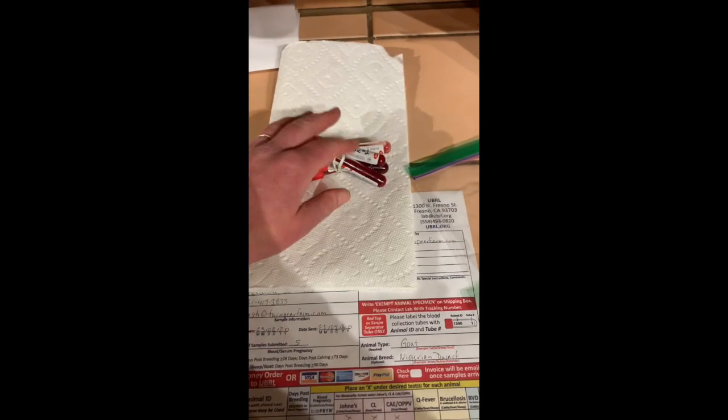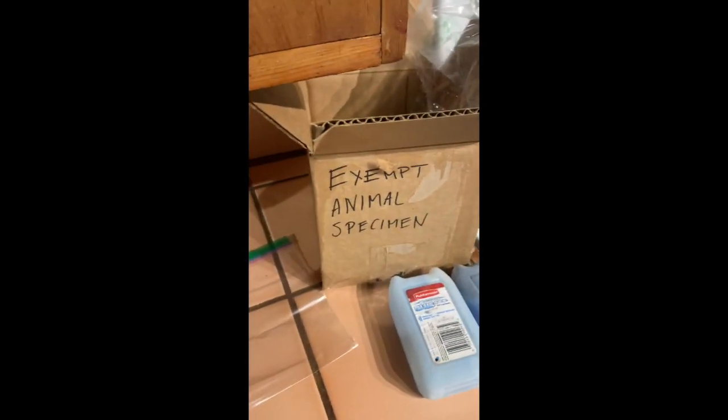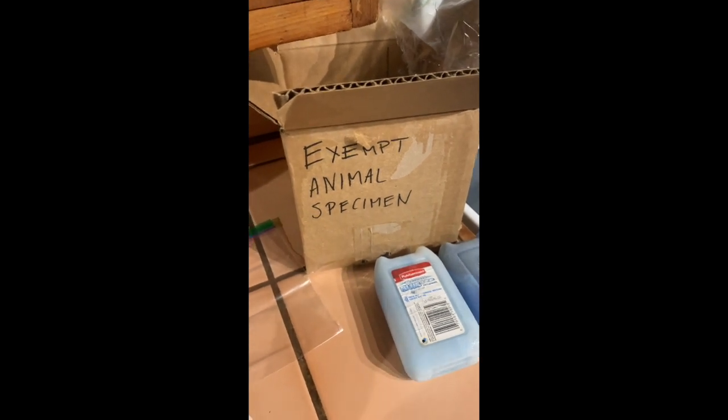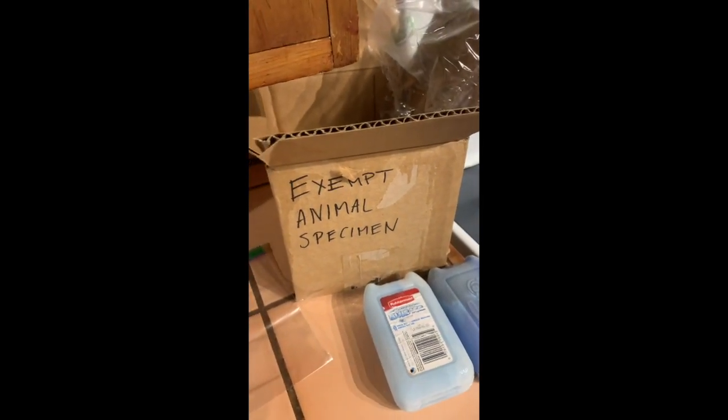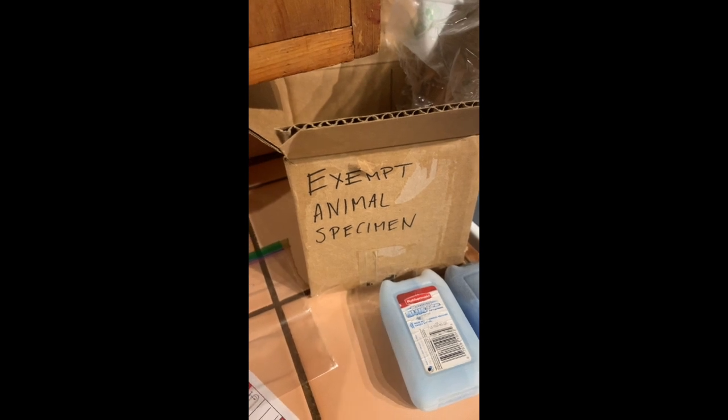We refrigerated them and now we are going to box them up as per our lab's requirements. We bundle up our vials in a rubber band, they get wrapped in paper towels or newspaper, and they go inside a plastic ziplock bag labeled biohazard. This is going into a box that says 'exempt animal specimen.' I put in some bubble wrap in there, and these samples — because we are doing biosecurity on these goats — need to go on ice.